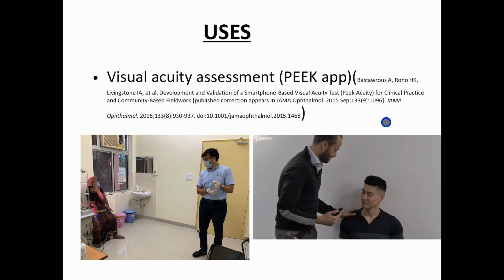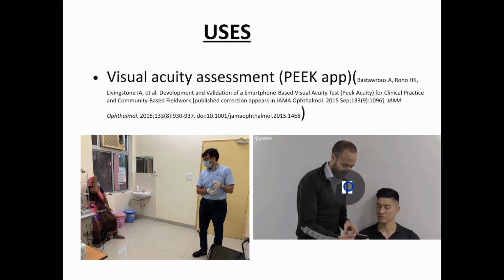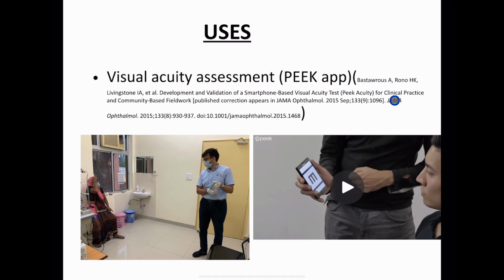Now I'm going to test your eyes, so if you can just rest your head back against the wall. Now this test uses the letter E and it changes in different directions. Type Peak on YouTube and you can watch the whole video at your own leisure.